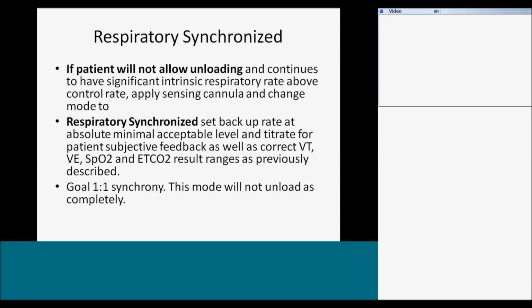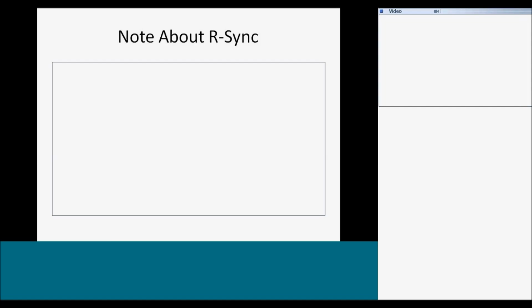Now, there is a mode called respiratory triggered on the RTX. We don't recommend using that. It is generally found to be uncomfortable for the patient. So either control mode or respiratory synchronized.